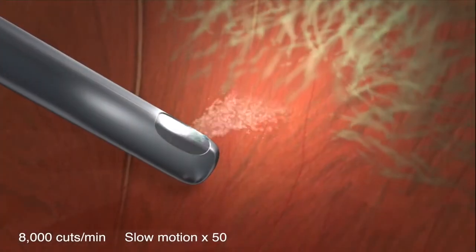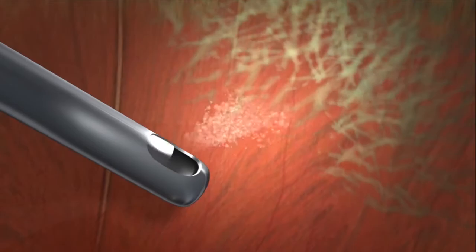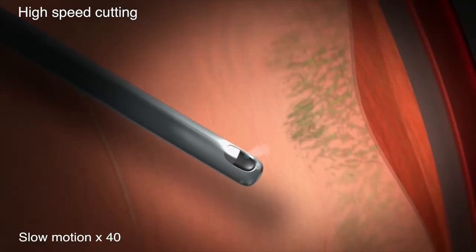What happens when the frequency is more than 2,000 or 3,000 cuts per minute? In 1/200th of a second, the BSS does not have the time to attract the vitreous, and the only thing that goes into the port is the BSS. This was shown very clearly by Philip Koch with a high-speed camera.